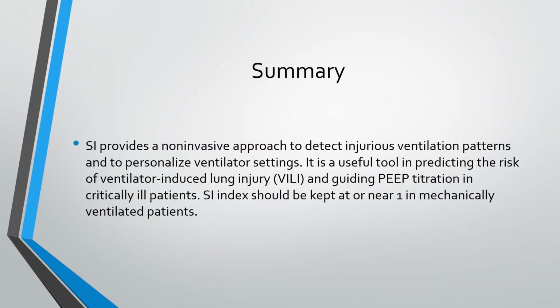So to summarize, stress index provides a non-invasive approach to detect injurious ventilation patterns and to personalize ventilator settings. It is a useful tool in predicting the risk of ventilator-induced lung injury and guiding PEEP titration in critically ill patients. Stress index should be kept at or near 1 in mechanically ventilated patients.